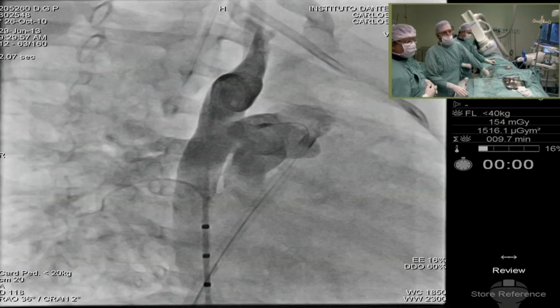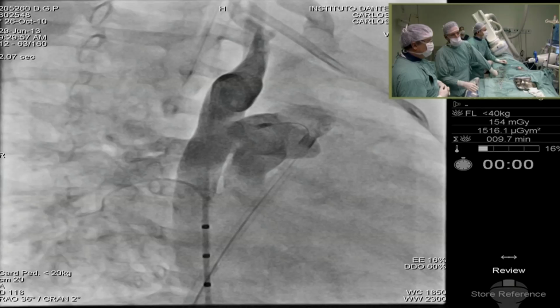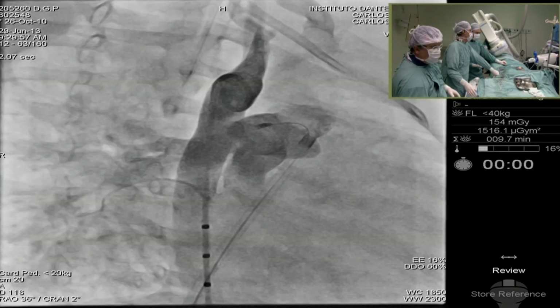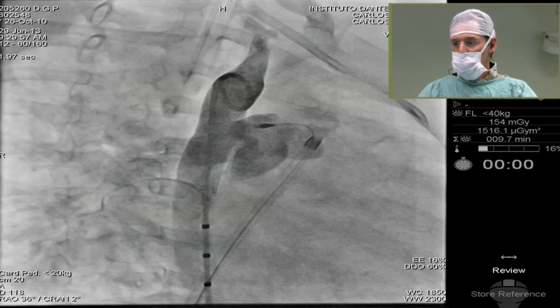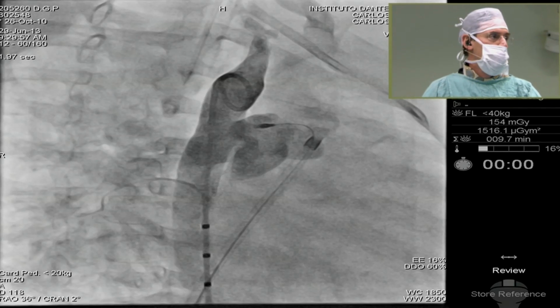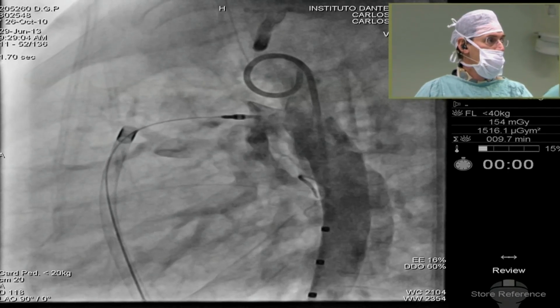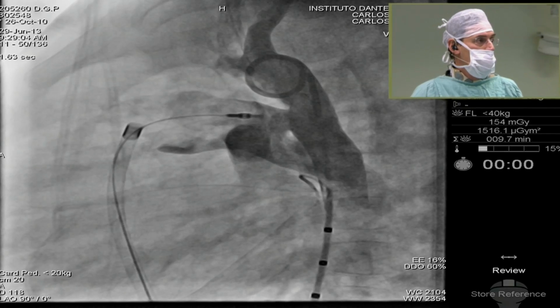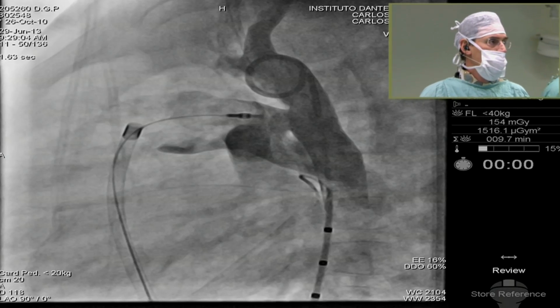No, we're worried about the size of the device inside the aorta. Yeah, but he seemed to be wanting to use a larger device because he was worried about the PA pressure. I don't think that's necessary. Use a sensible sized device and the PA pressure will get better. So I think the device is definitely too large, but you can now measure the smallest diameter of the device in this position. Can you tell us the diameter there?